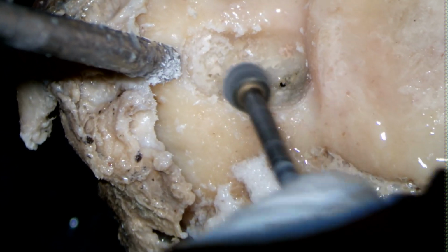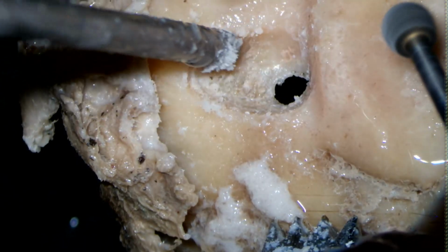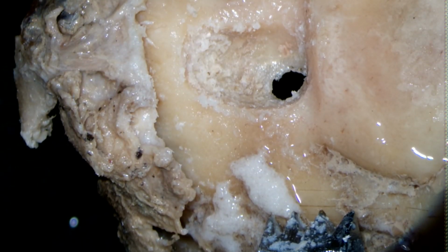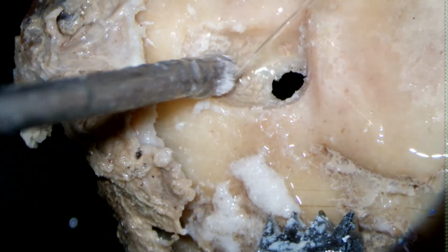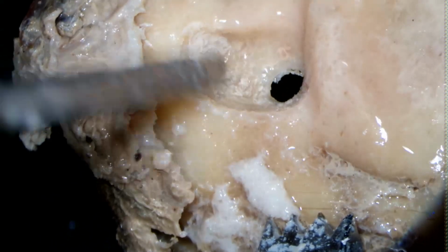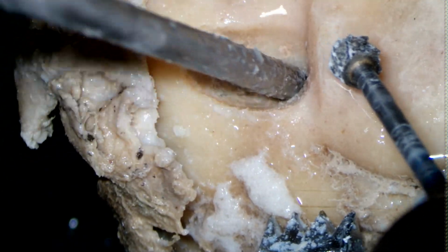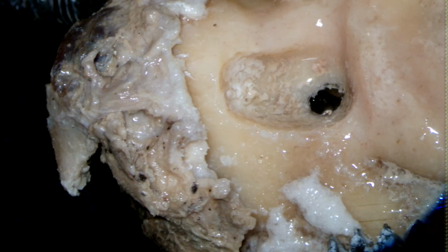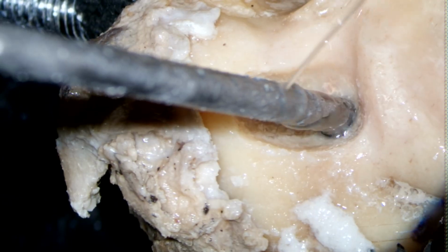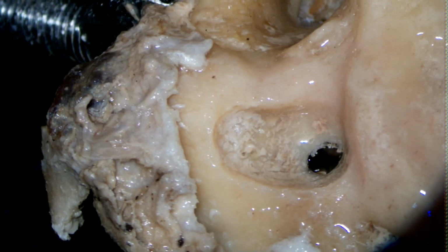Okay. I thought we have damaged the dural plate. So again this is a contracted antrum I suppose. We have damaged the dural plate I suppose, isn't it? Okay, okay. Can I have a smaller burr?